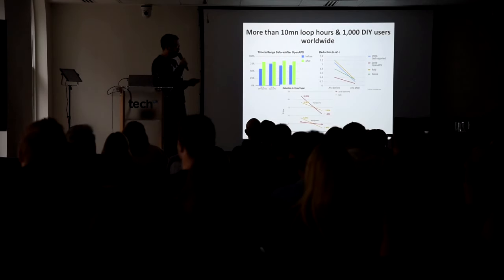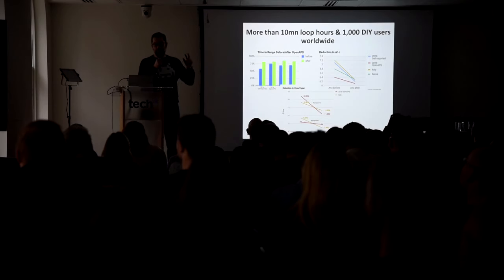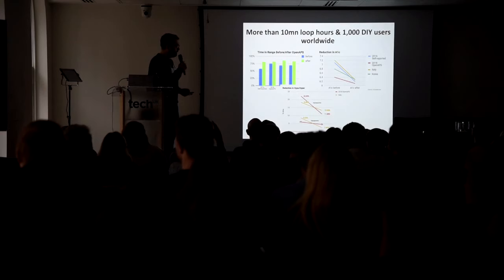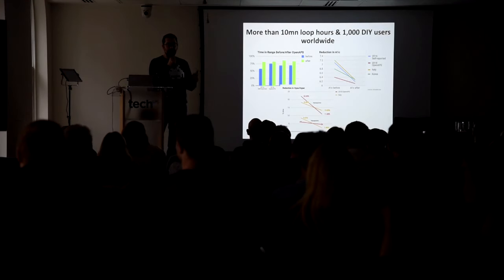There have been a few studies that have been done, and that's what this data is pulled from. There was a 2016 self-reported study. 2018 is an interesting one. It takes the Data Commons data that has been submitted and uses that to show people's before and after numbers. You've got an Italian study done by a clinic in Italy, and there's another one in Korea which focused on kids, and they've all shown an interesting result in terms of before and after. I think what all of these graphs show you is that the people who were put on these before had pretty good numbers compared to the general population. They all saw improvements, but it's still an interesting point.